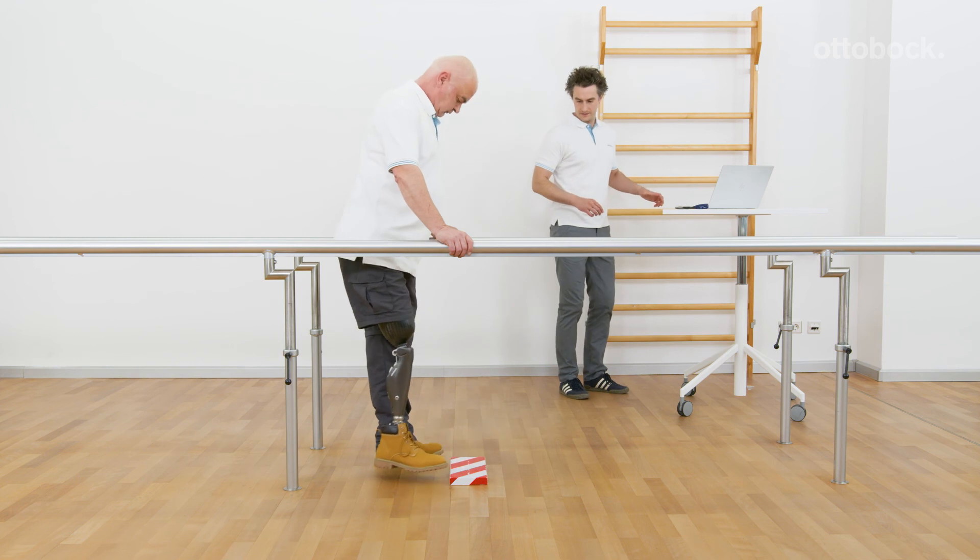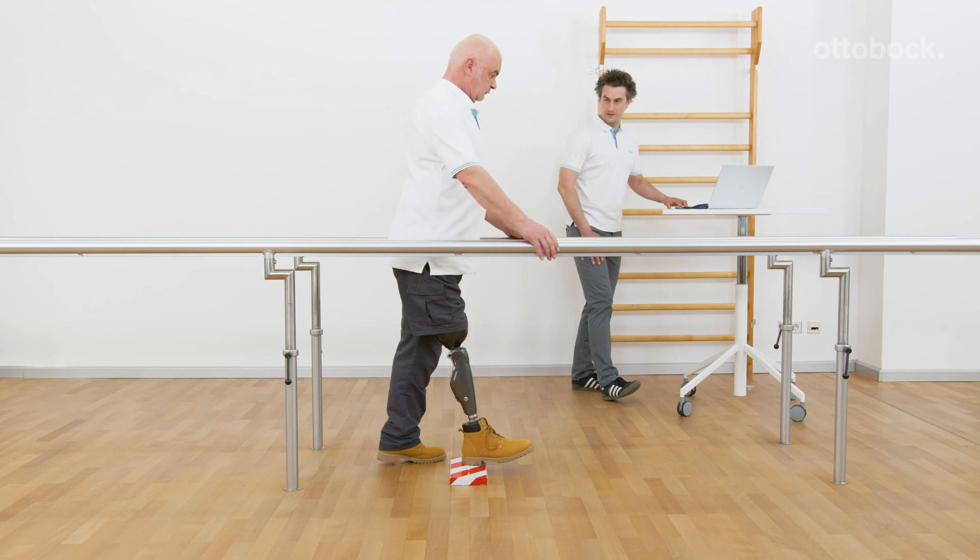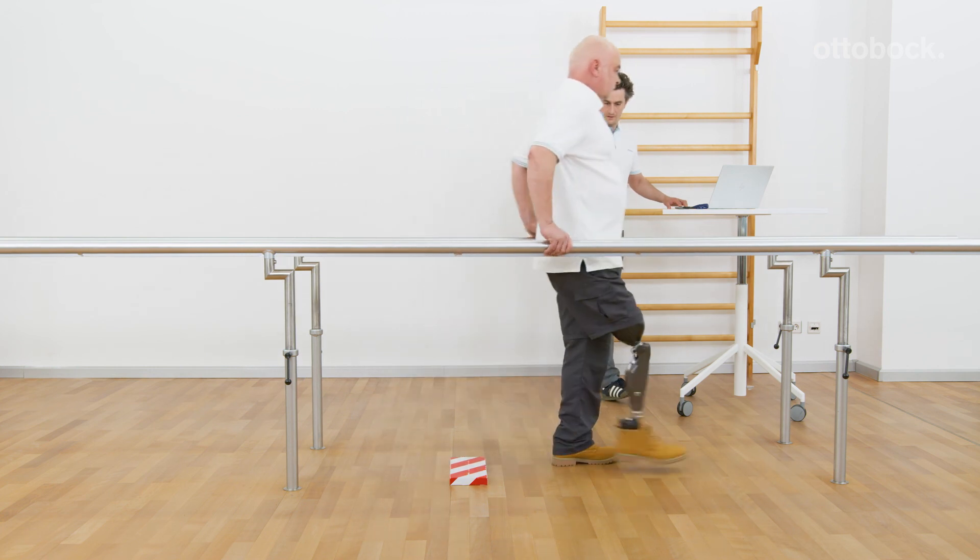It is very important to consider the abilities of the user and point out the risk of falling when a lower safety mode flexion resistance is requested.